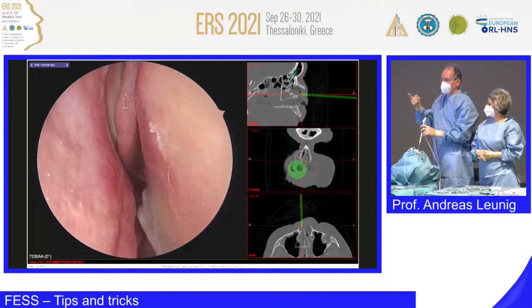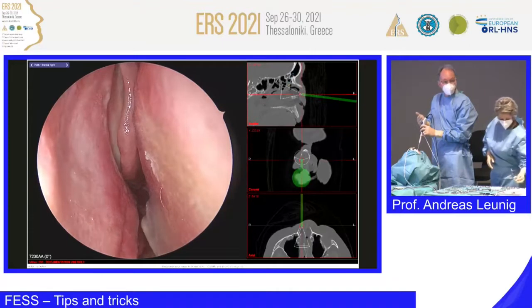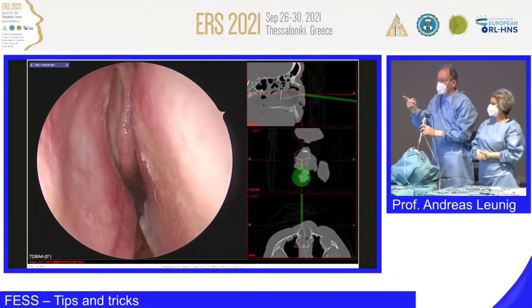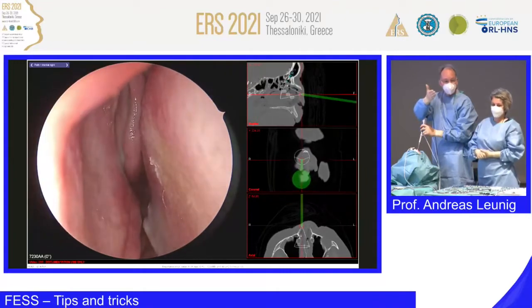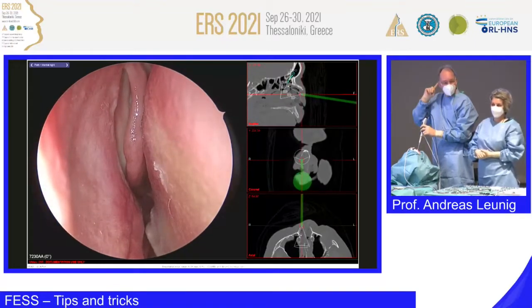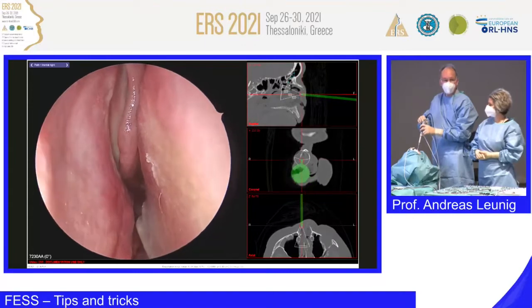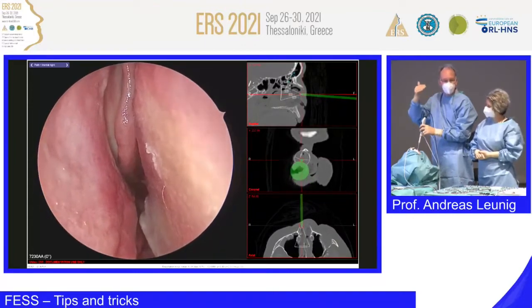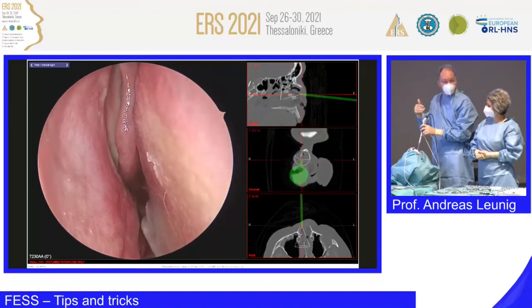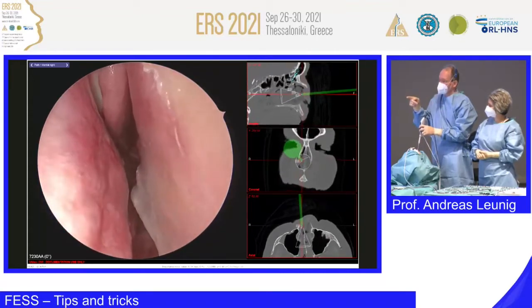So my question is, how would you handle this septum? Maybe it's making the entrance in the middle meatus a bit difficult. And if yes, how, may I ask you? Just give me some recommendations. Okay, you would remove it. Well, classical septoplasty. Okay, that's good. So you would do a so-called mini septoplasty or endoscopically guided one. That's what we do in many cases. So this is what I want to give you as another tip and trick, just to handle this endoscopically. This is very easy.